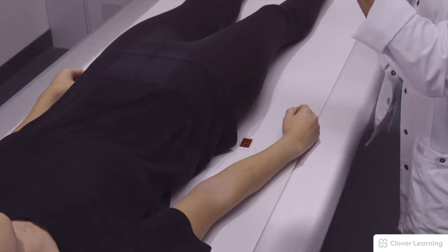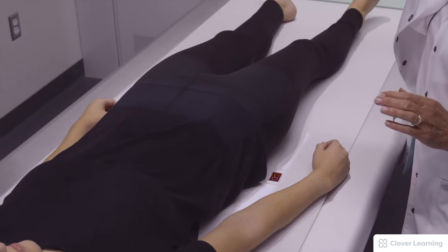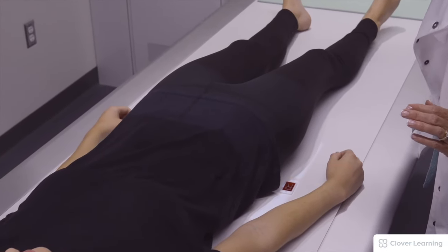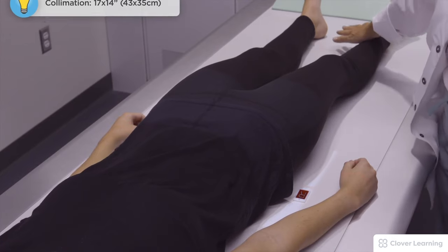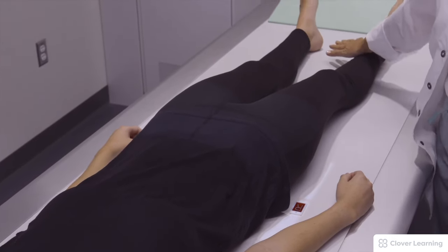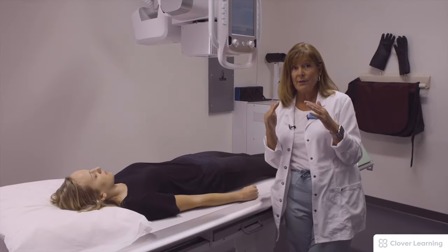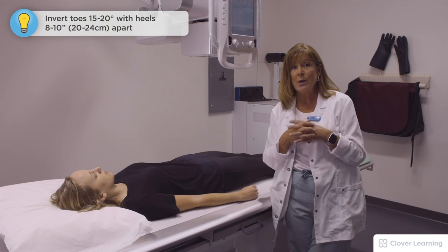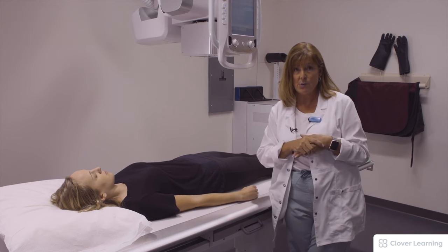I'm going to open our collimation to a 17 by 14. Her heels are 8 to 10 inches apart and we're going to roll her toes together 15 to 20 degrees and invert those toes.